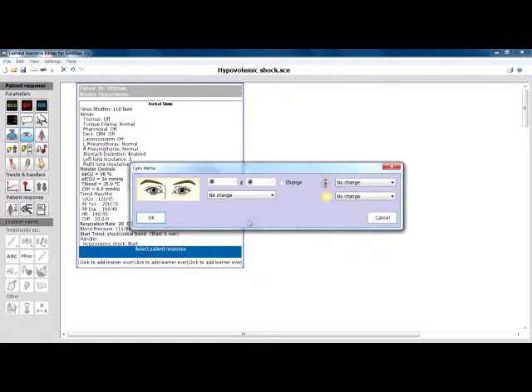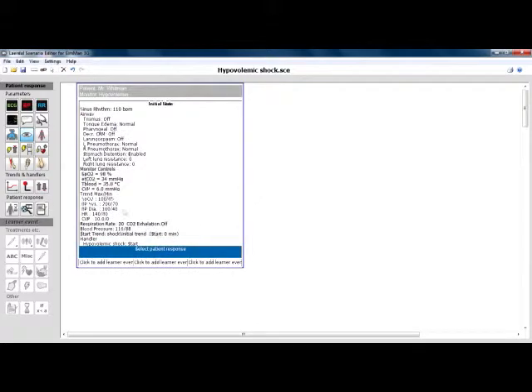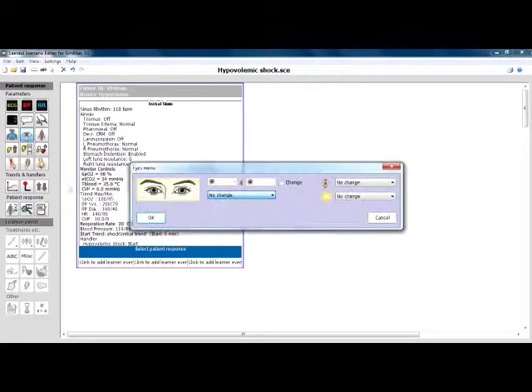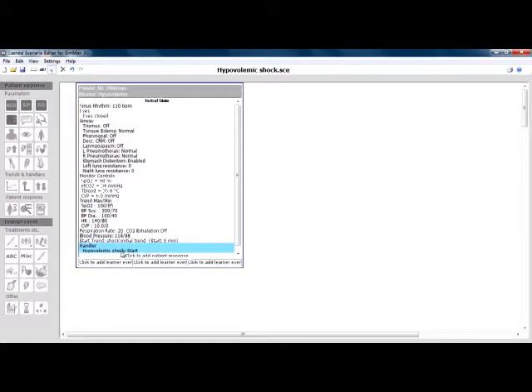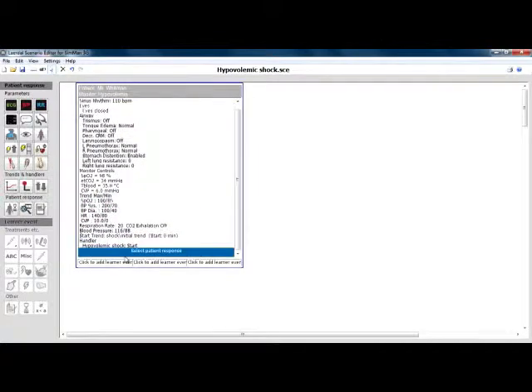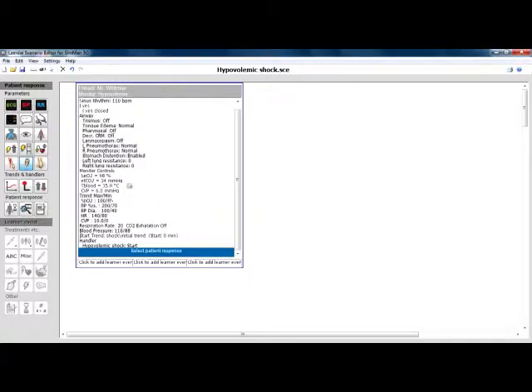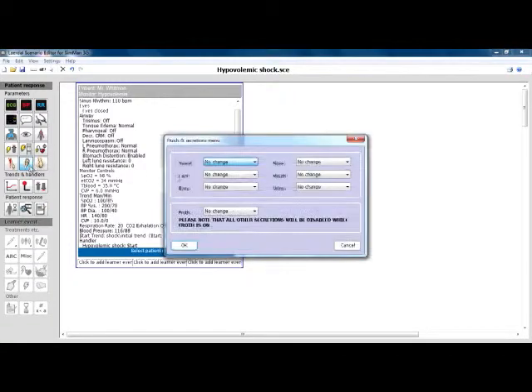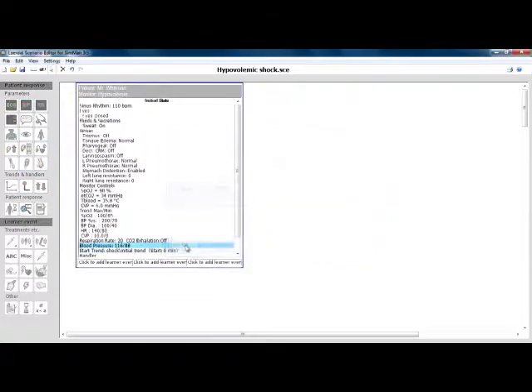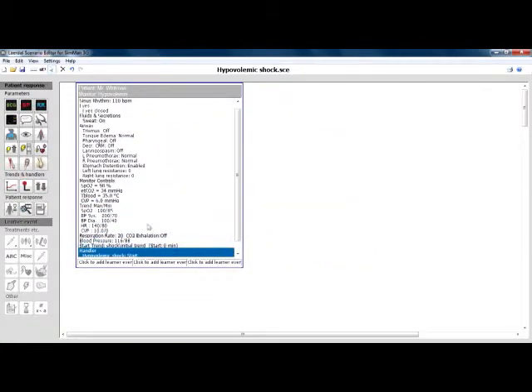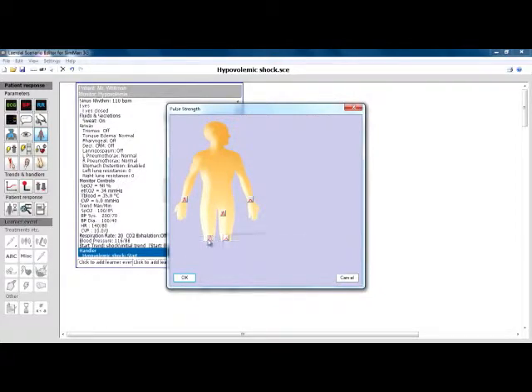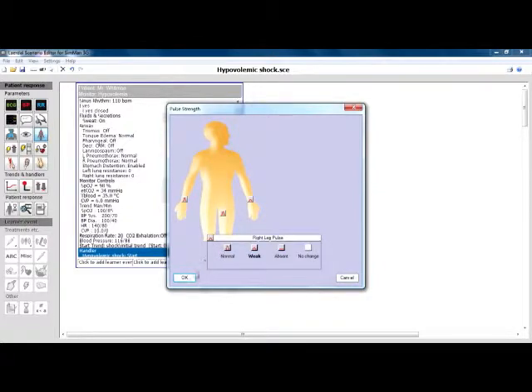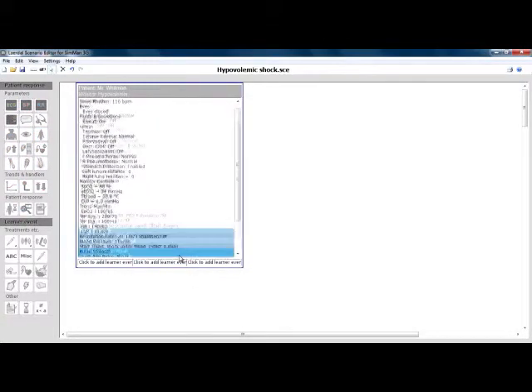Open, close eyes where necessary. Adjust pupils if possible. Add fluid capabilities where desired if possible. Adjust lung resistance and compliance. Adjust pulse strengths where applicable. Add seizures if necessary.